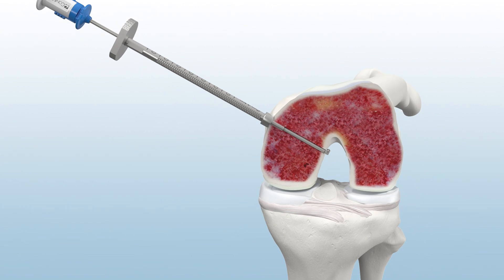With the drill in forward, activate the Retro Reamer away from the femoral aperture and gently pull against bone until the proper graft tunnel length is observed.